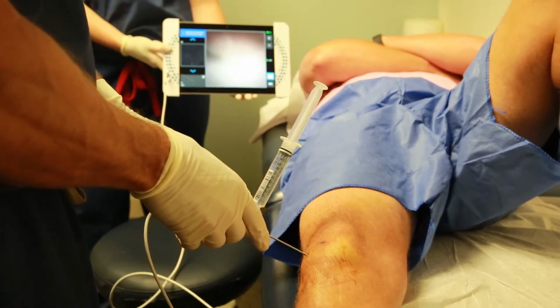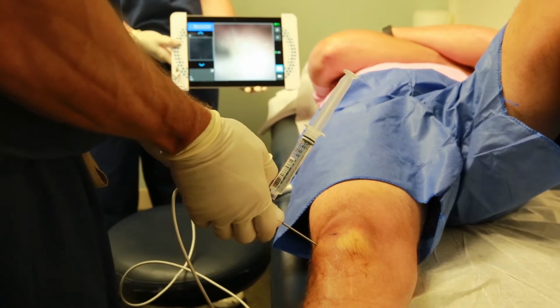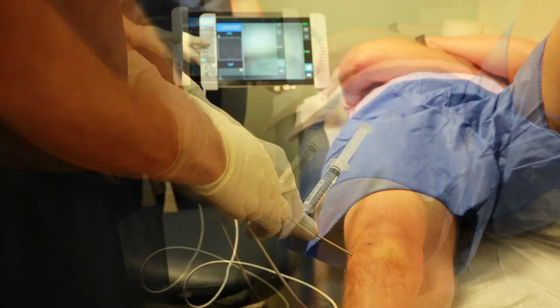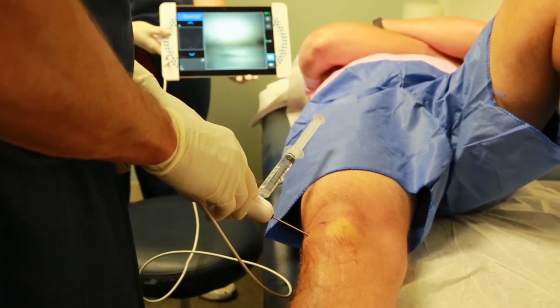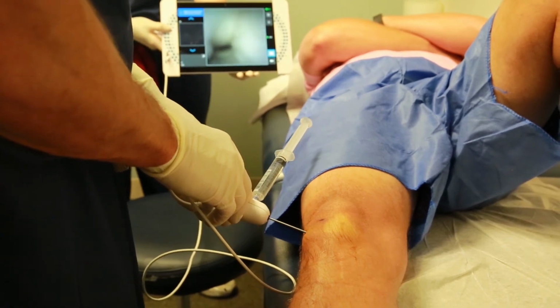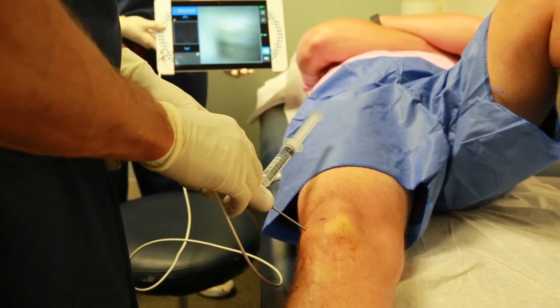And then once you get in, we can kind of feel where we are. Take your time when you get here. So now there we go. We know we're in the compartment. We can see his medial compartment. There's some stuff on the outside here, and he's had a previous meniscectomy.